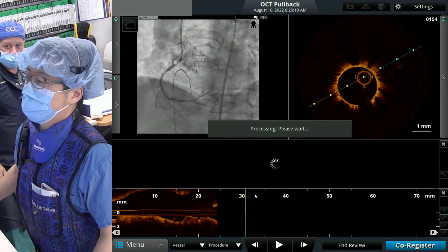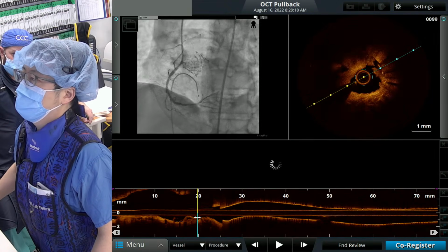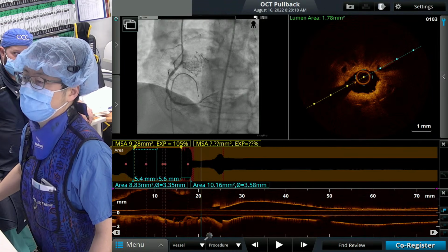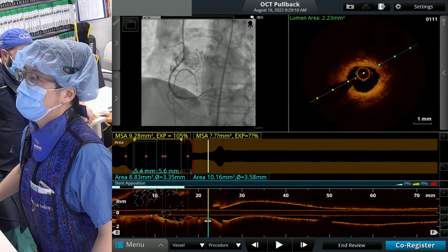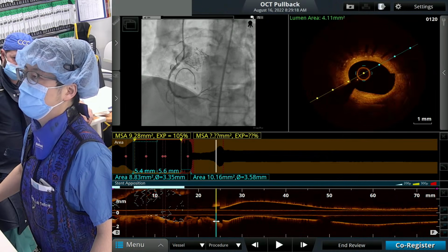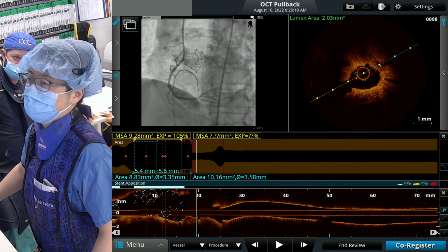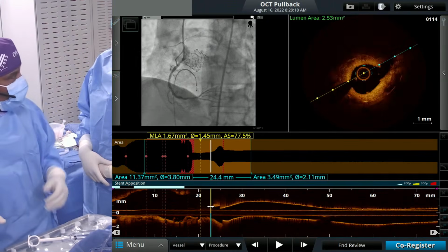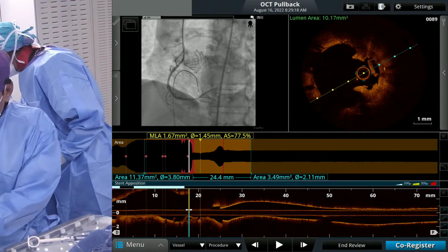So I show you this is after the ELCA. I see some intimal disruption after ELCA, like irregular surface. Yeah, still stent is underexpanded, but it looks like not much calcium again. So coming back to the point, if there is just a plaque and it's not calcium, what size balloon you have? 4.0. We're going with a 4.0. I think 4.5. No, but let's do 4.0 first and then stent we can put 4.5.